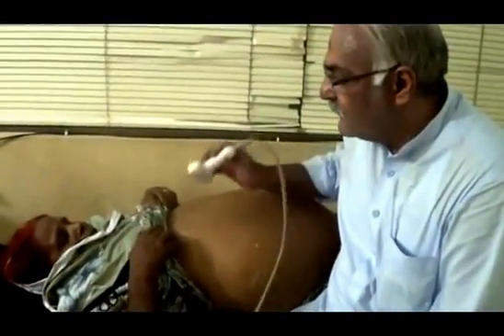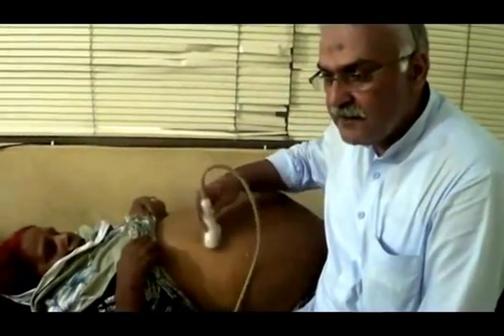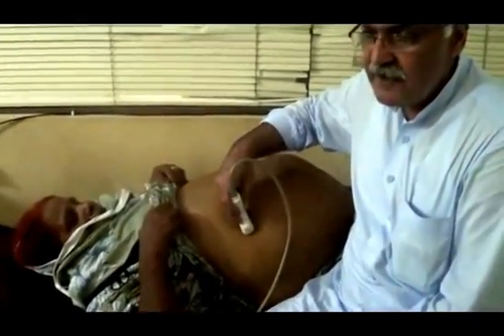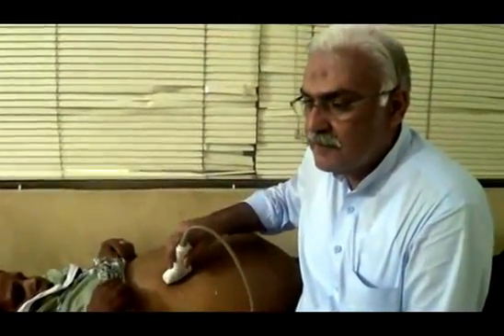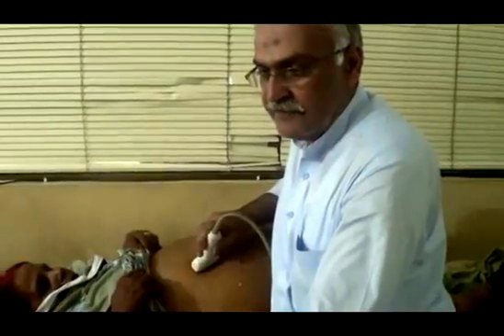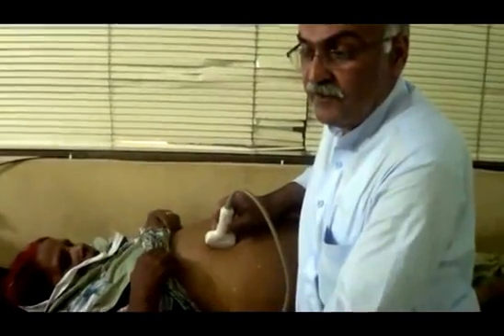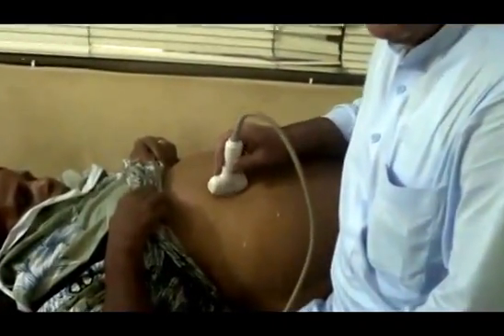This is a 50-year-old female with a complaint of severe pain and vomiting in the right region. I don't have any lab profile, detailed clinical history, nothing. So we have to do it on our own. Let's see what is the pathology and the cause of her problem.